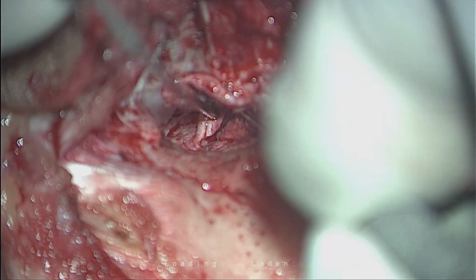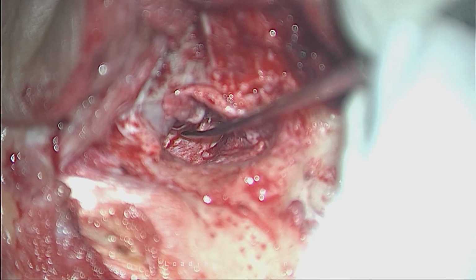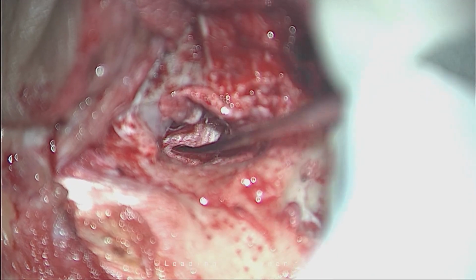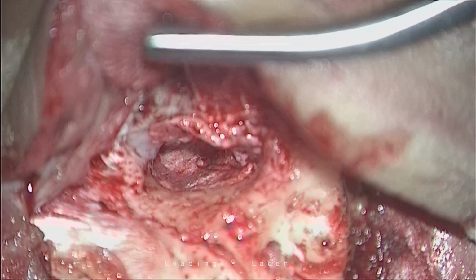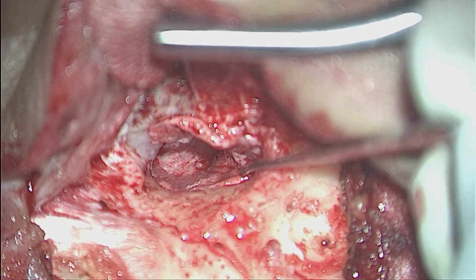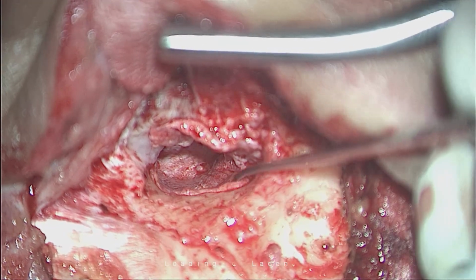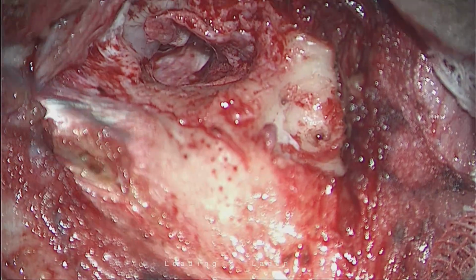This is a large central subtotal perforation, boss. Yes. And see, I have pushed the graft underneath the malleus. Can you see? Yep. It's very important to go below the malleus. And to maintain it, I have spread it edge to edge in the canal. This is my first part.